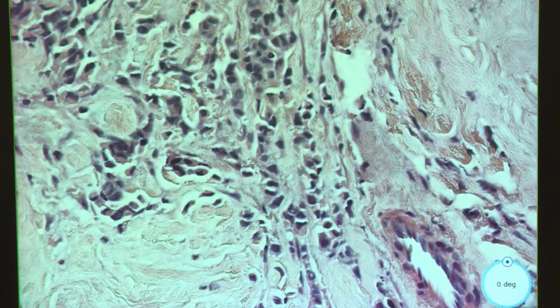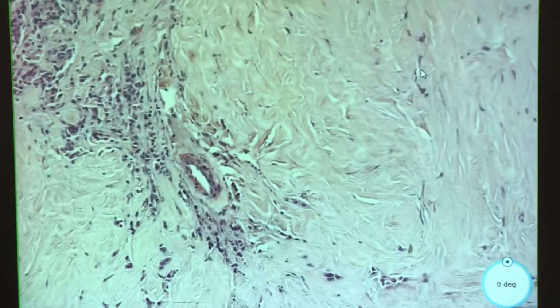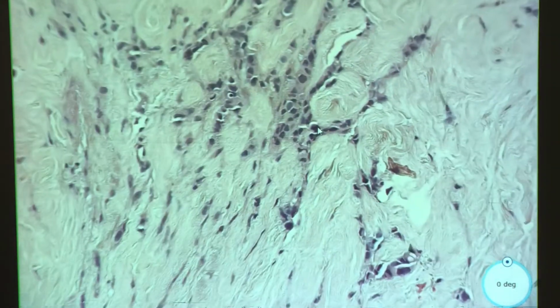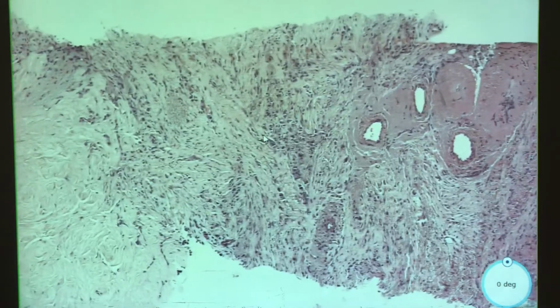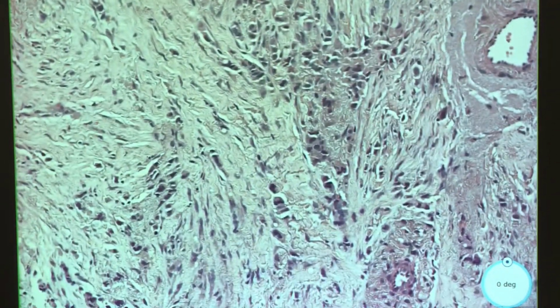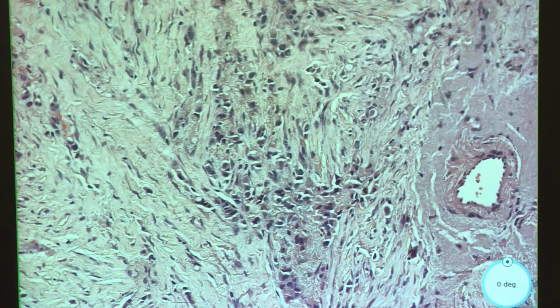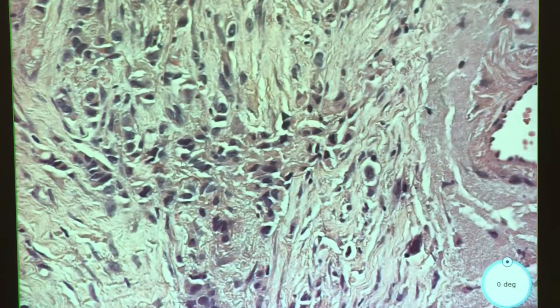Really helps you when you aren't sure, because sometimes you can have invasive ductal or invasive carcinoma, no special type, that will have these squished glands, or they're kind of on their side, like they're tangential, and it can really look like lobular carcinoma, even though it's not. With this one, we have all these single cells. They're definitely lining up. We have the intracytoplasmic mucin. So this again is another lobular carcinoma.